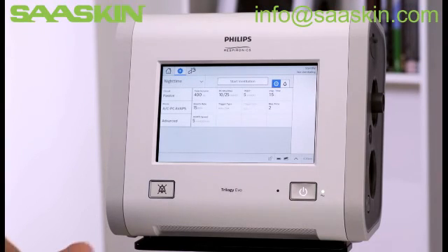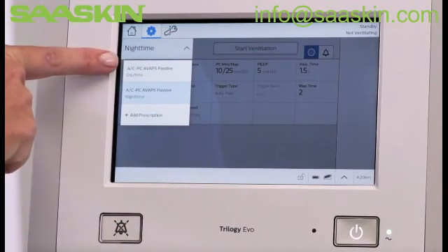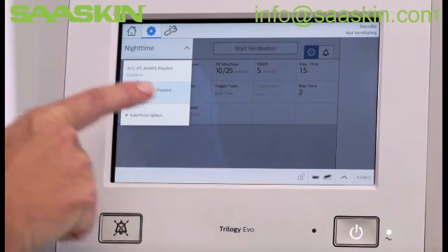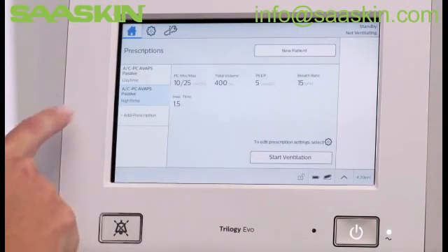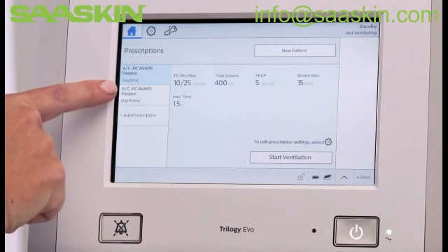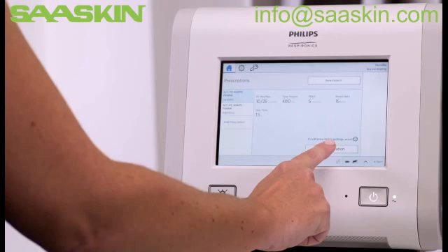While still in Settings, you can select the desired prescription from the drop-down menu and tap Start Ventilation. Alternately, you can go to the Home window and select the desired prescription on the left-hand side, and then tap Start Ventilation.